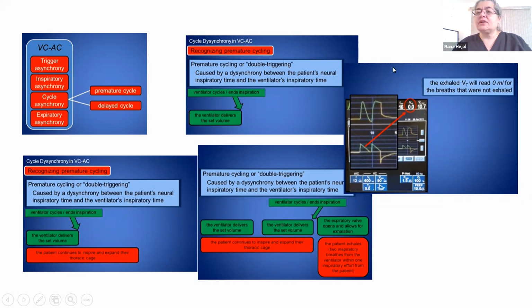In reverse trigger, though, you have something like this, but you will see nothing active on the patient. Reverse triggering is related to neurorespiratory coupling, a musculoneural coupling that all of us have, and was studied predominantly in people with exercise.